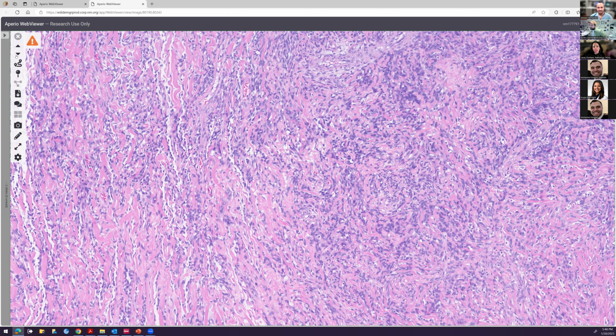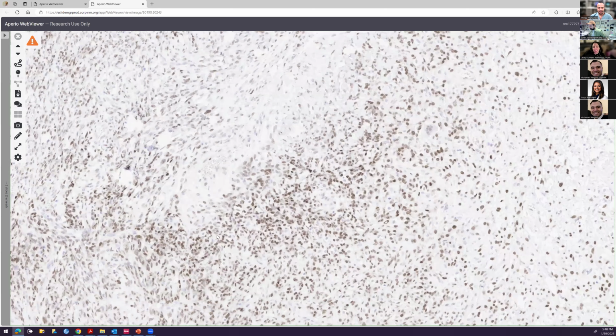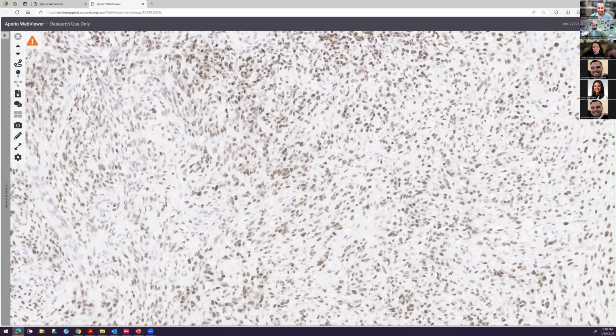But you did say you wanted a STAT6, so I do have a STAT6 for this one. And here's your STAT6, nice and positive. What is STAT6? What's this from? Why is it STAT6 positive?